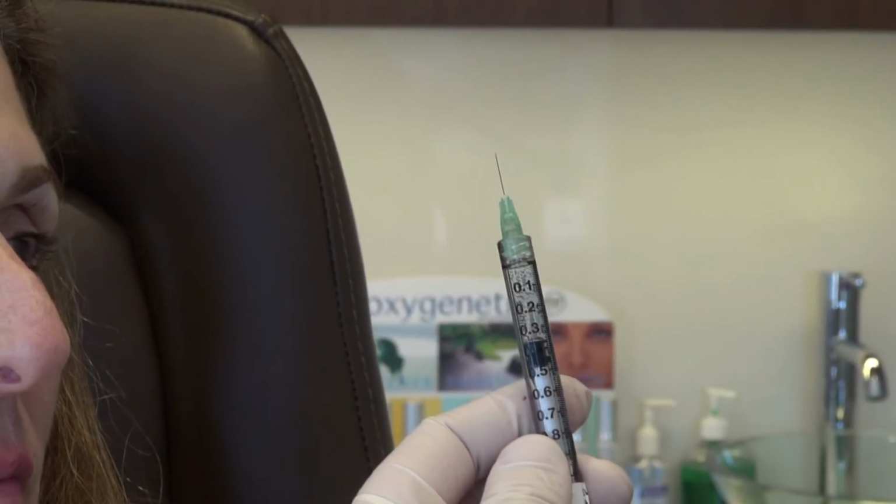So we've used 1.65 cc's of dilute Juvederm. Here's the mirror. So here's what it looks like. I don't see any major bruising at all. I see it much smoother. This will go down a little bit. This is a little teeny bit swollen. That'll go down. I'm going to just put a little bit right over here still. There's still a little teeny hollow area right there. But otherwise, so much better. So much better. Yeah, this is really nice.